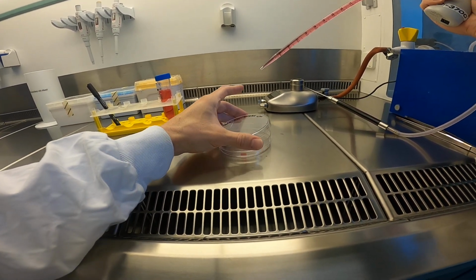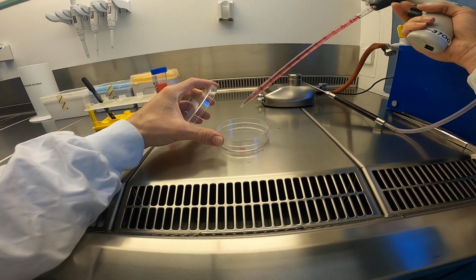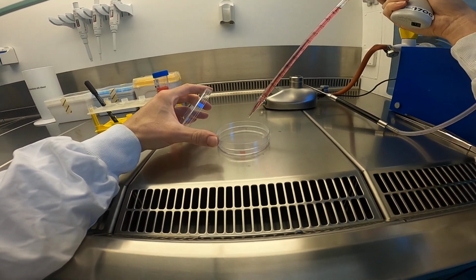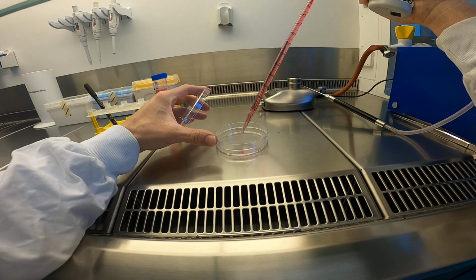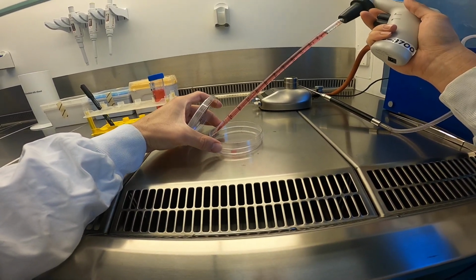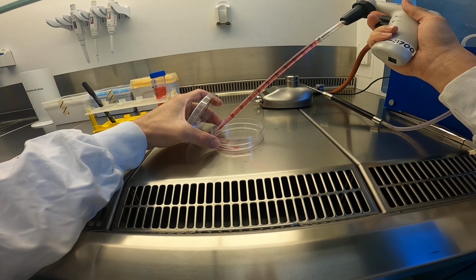Pull this towards me. And then the way to put the medium in the plate is not by just pushing it with full force at the center of the plate, but by doing it at the side of the plate and then slowly.